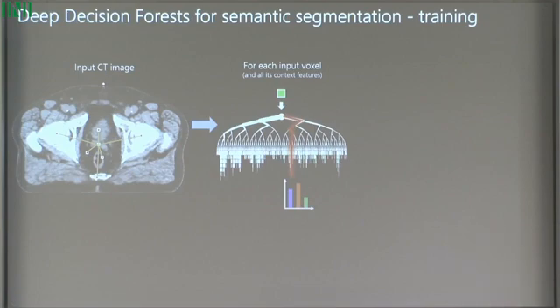And for that, there are two innovations to the standard deep decision forest algorithm that we employ. The first is that we have a forest that does some kind of latent clustering to deal with severe class imbalance that usually arises from medical images. As most of you know, most of the image is dominated by the background, and that really can be quite confusing because it presents very weak signals for the machine learning to learn from.